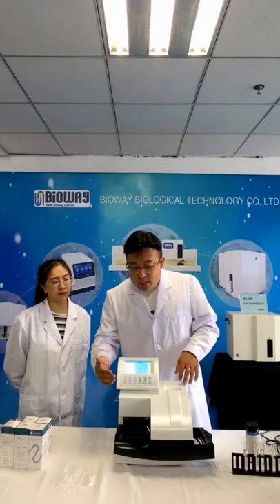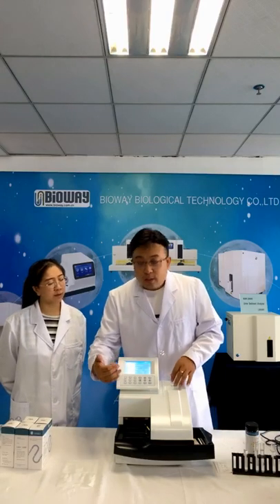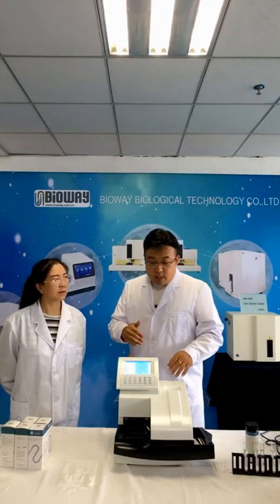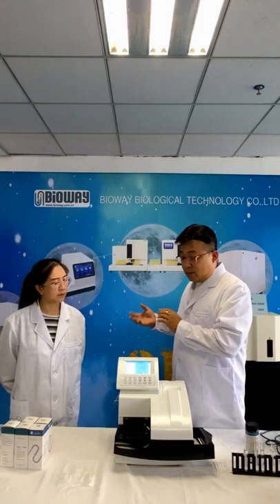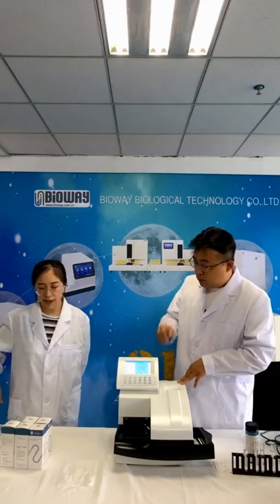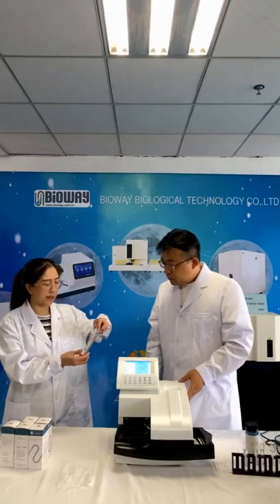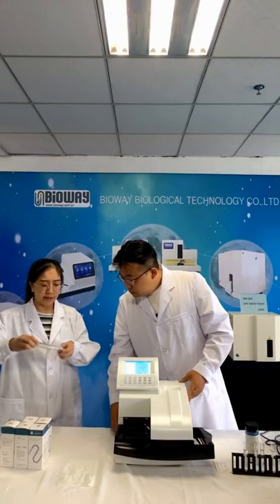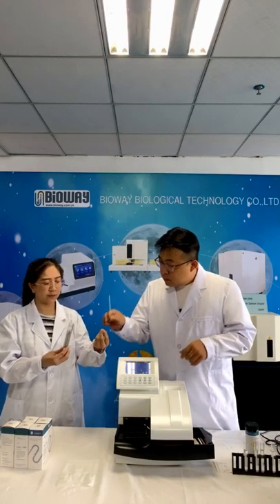So we can see the pusher putting the strips into the machine, and then after that it makes the report. And also, does this one still have the calibration strips? Yes, we still have the calibration strip for it. You can calibrate the device with this.